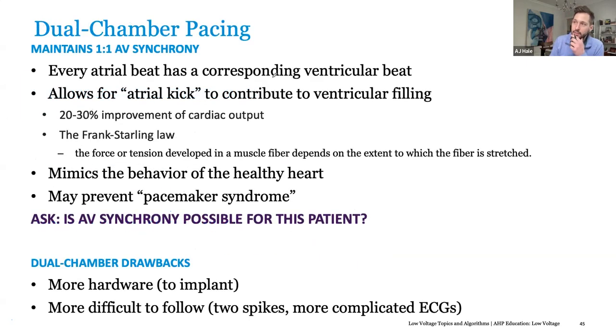Dual chamber pacing. So you always have an atrial beat corresponding to a ventricular beat. You'll allow for that atrial kick, which is 20-30% of your cardiac output. Frank-Starling law, Elvis, I'm sure you know this, but if not, study it because it'll come up.